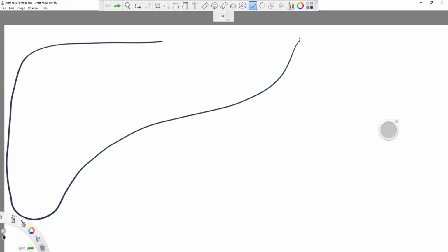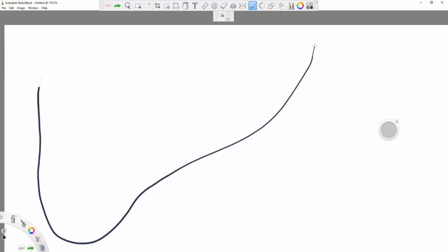But so here's a liver with an unusually large left lobe. In fact, that's so large it'll actually throw off my image here. So let's do it more like this. Okay, that's probably a little more realistic. But let's think about what it looks like in the ultrasound view. Ultrasound view.